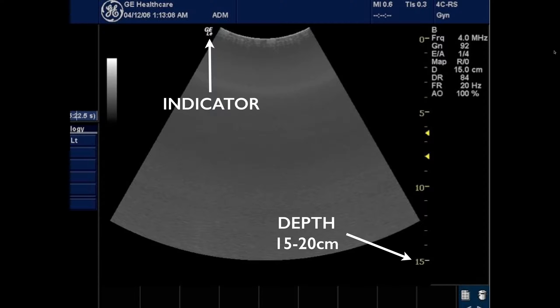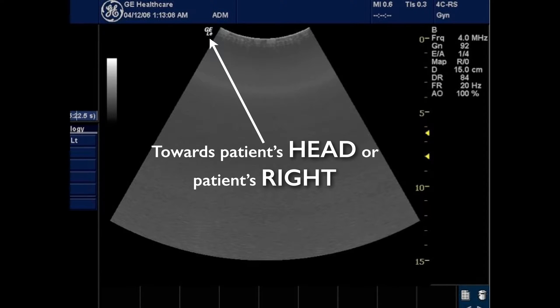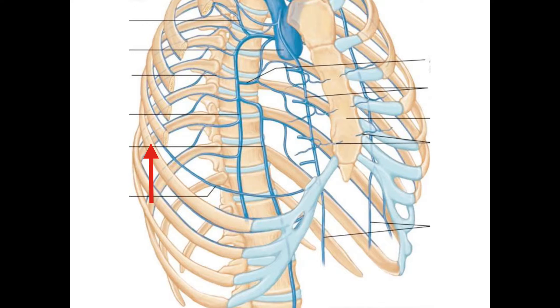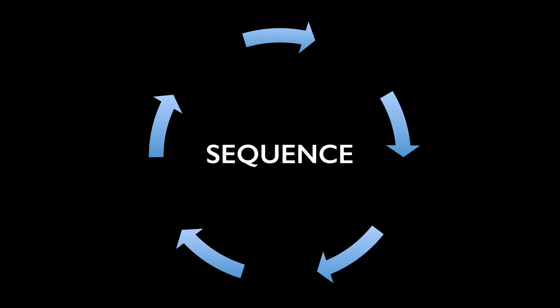The depth is about 15 to 20 centimeters. The indicator for the FAST scan is generally towards the patient's head or right side. If you have obstructive views because of ribs, you can turn slightly counterclockwise to minimize rib interference.